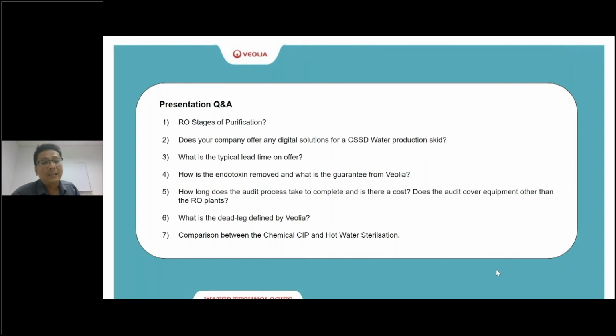I'd consider heat sanitization an easy sanitization approach because it can be done in a short duration if done frequently, per se, every week or every month, within 45 minutes, 1 hour, 60 minutes or less. And it could be automatically adjusted or even initiated from the system itself.